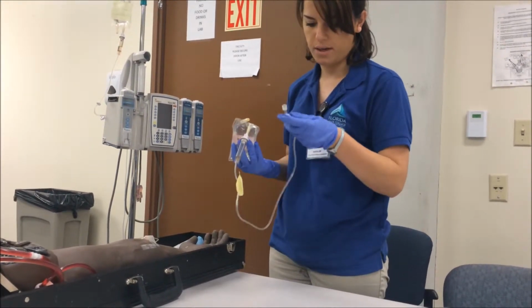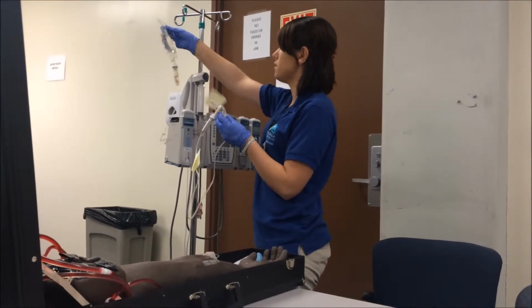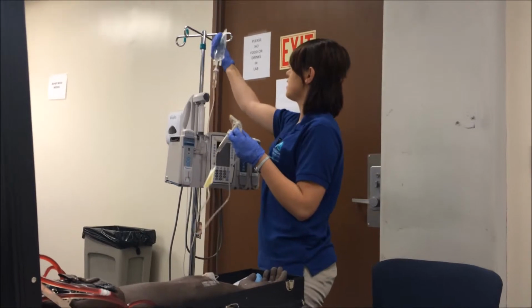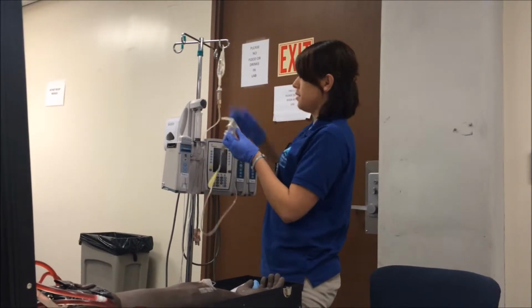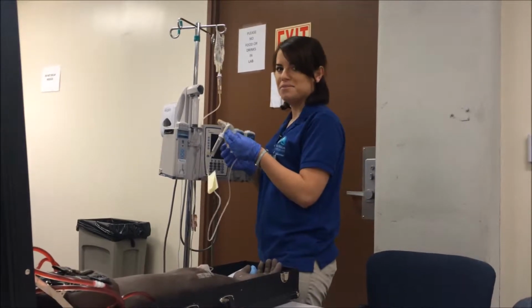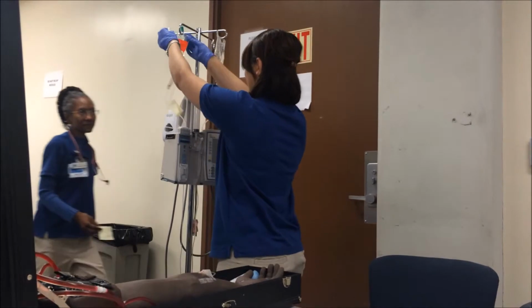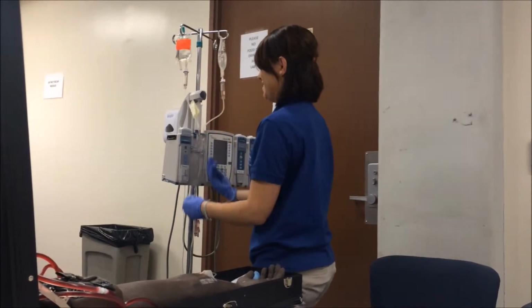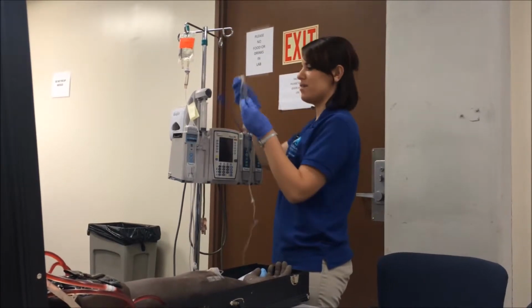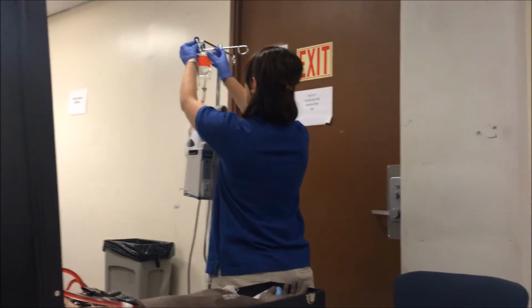Make sure it is clamped, because I don't want any of it to come out flying. So I'm going to go ahead and move my primary. My primary was already labeled, but the labeling fell off. Okay, and what I would do with my primaries, I would actually lower it down and hang it right beside my piggyback.